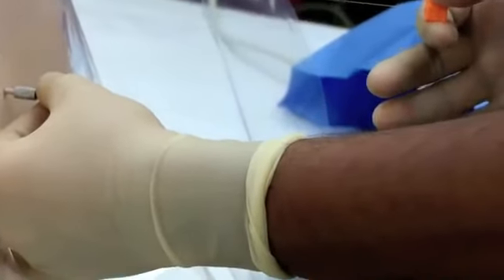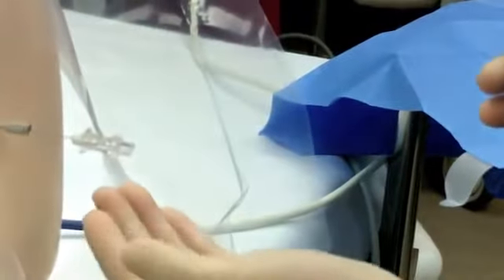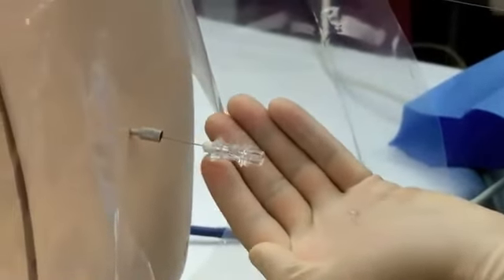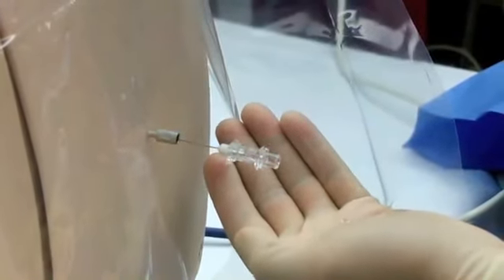And you confirm CSF flow by aspiration before and after injecting your anesthetic. You can see that there is some fluid coming back. It's difficult on the camera, but there is some CSF coming out. That's our confirmation that we are in the correct area.